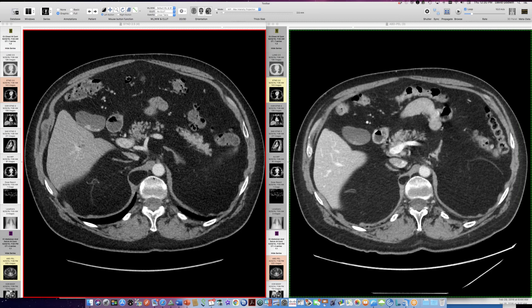I don't remember this one from you. I remember showing a more heterogeneous fatty lesion in the diaphragm and you said it was a lipoma and sent me an article — but yours is nice and clean and fat. I think yours qualifies as an intramuscular lipoma. I was fascinated by that case — there is some literature for that intramuscular pattern. Basically you have the fatty tissue sort of extending along the muscle fibers and separating them — so it's a mix of muscle strands with fat. I've seen intramuscular lipomas in the chest wall before where they're mixed in with intercostal muscle. This one is just a more ordinary lipoma.